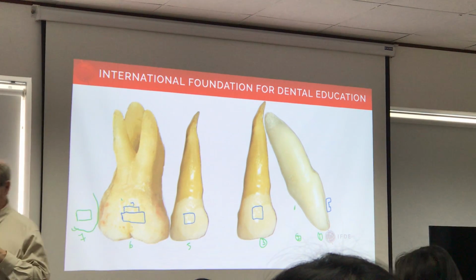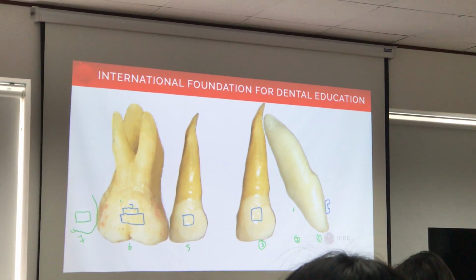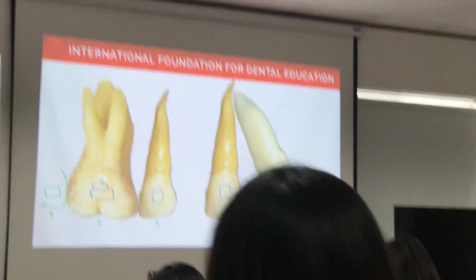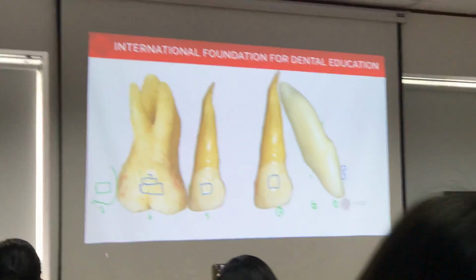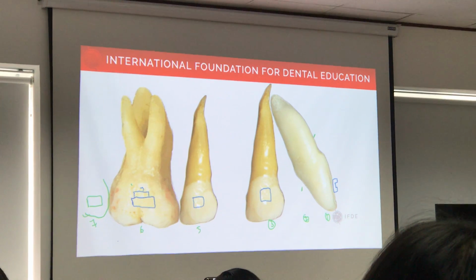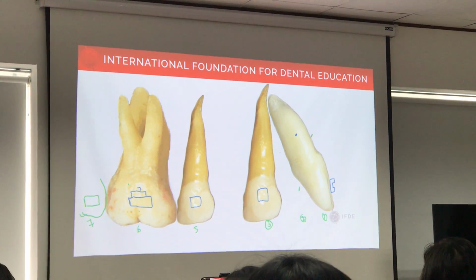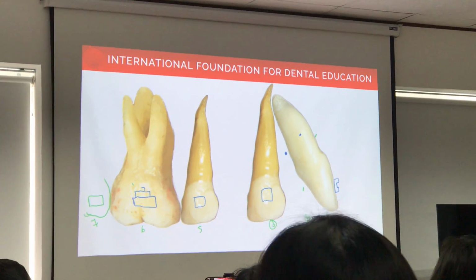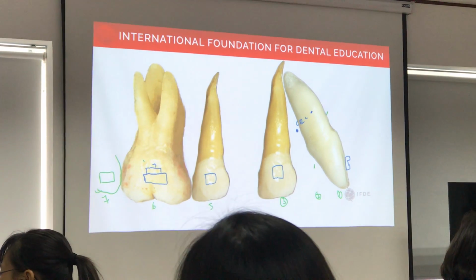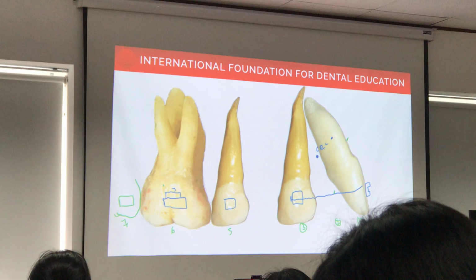So the idea now is you have, sorry, I'm going to find what I have here. I'm going to use blue because I can't find it. Okay. All right, so you are here. Okay. So that would be basically roughly the center of rotation resistance of the whole unit. Because now if you put the wires into the other side, it becomes a unit.